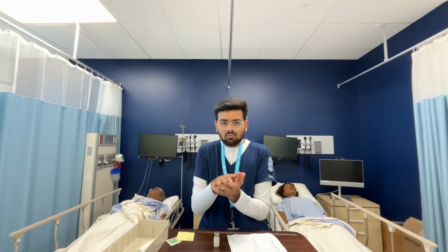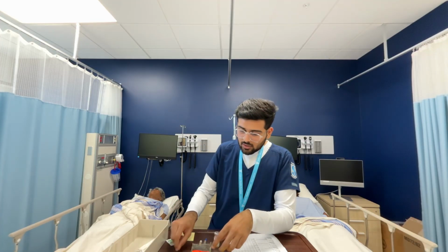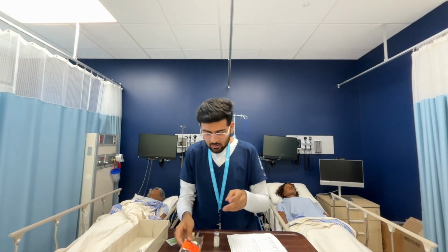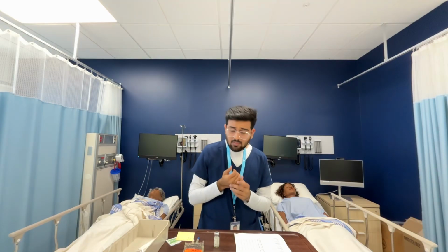I'm going to gently mix my medication. Now I'm going to label it. I have written everything, and I'm going to label my medication, then the piggyback, and it's ready. Now I'm done with my second check.